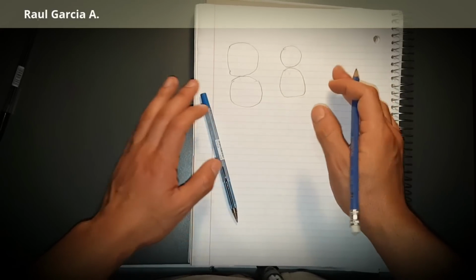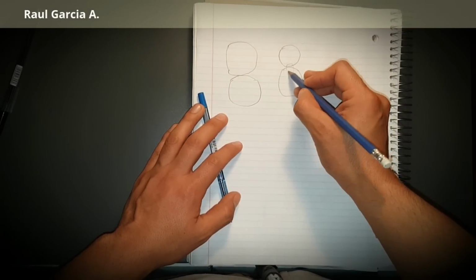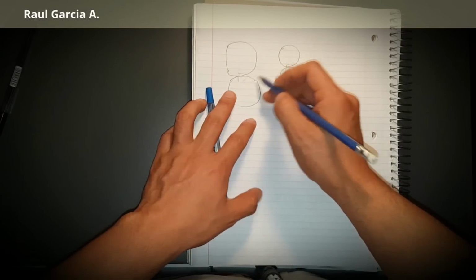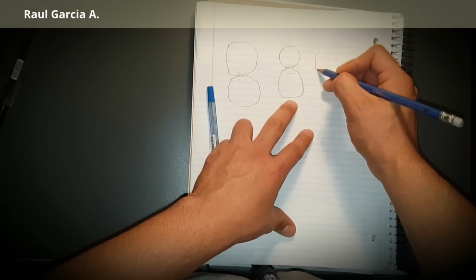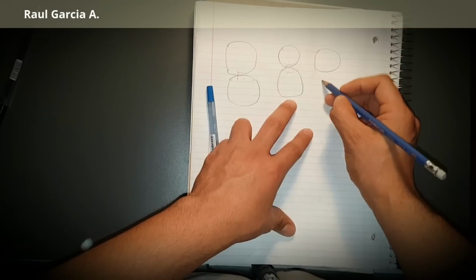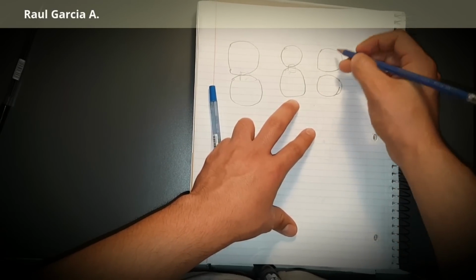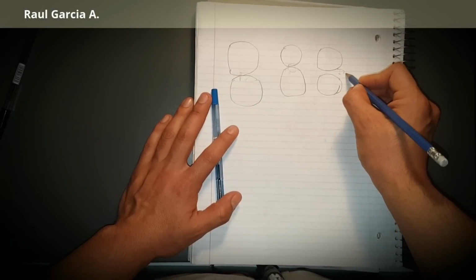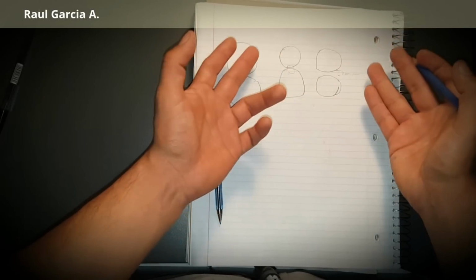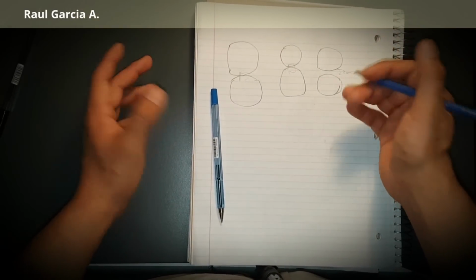And we usually use the embrasure clasp when we have some space here. Okay, so imagine this molar also. We have enough space first. And sometimes when we have little space, let's say 1 millimeter, like the molar drifted mesially, and now we have 1 millimeter or 2 millimeters. You do not have space to put a tooth there, but you can fill the space with an embrasure clasp.